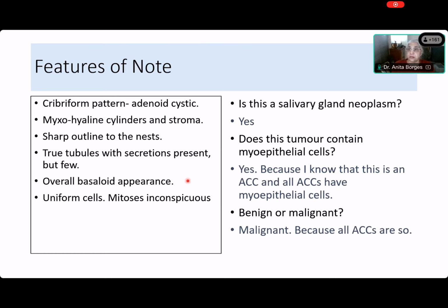All right, Akshara, please tell Somik why we call adenoid cystic carcinoma a carcinoma. This is an infiltrative tumor, and we also frequently find perineural invasion. Because it behaves like a carcinoma. That is the short answer to this, Somik. Everything that behaves like a carcinoma does not necessarily have mitoses and necrosis and this and that.